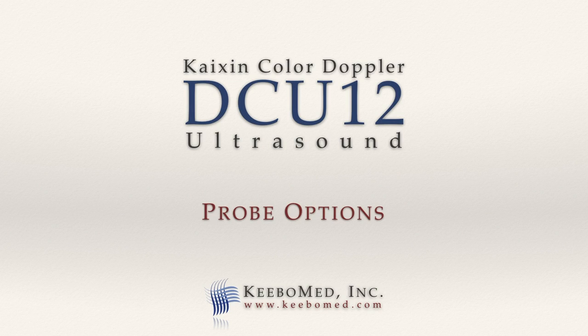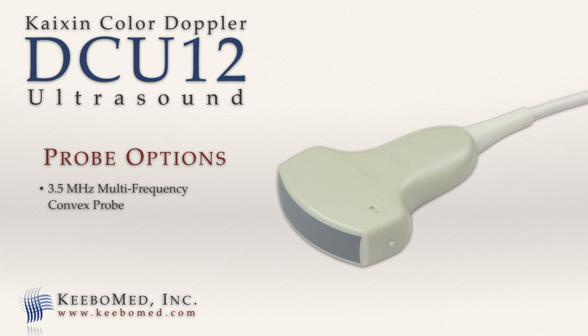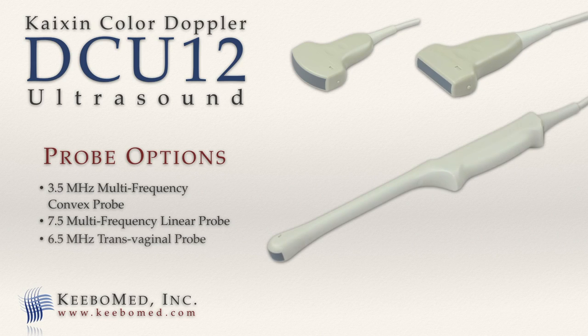The DCU-12 supports 3 different probes: a 3.5 MHz multi-frequency convex probe, a 7.5 MHz multi-frequency linear probe, and a 6.5 MHz transvaginal probe.